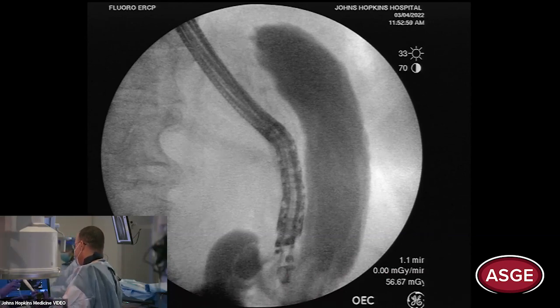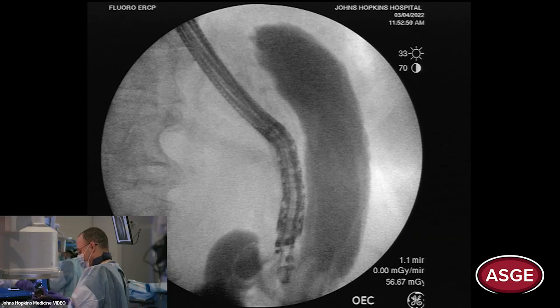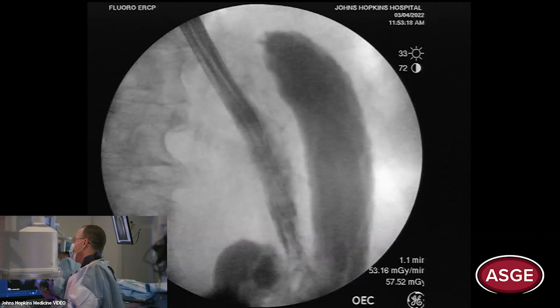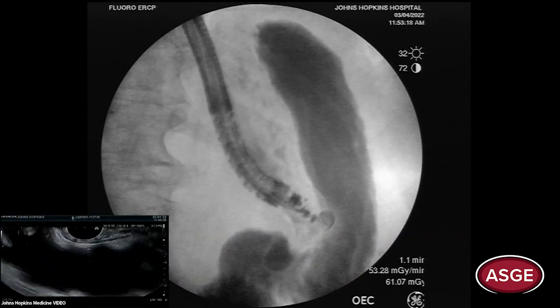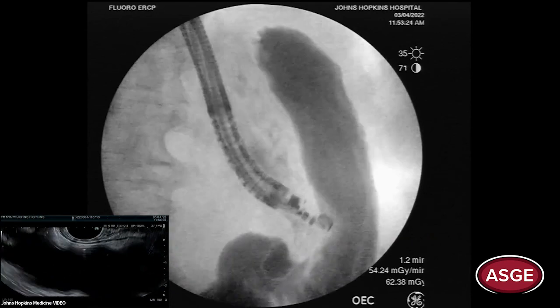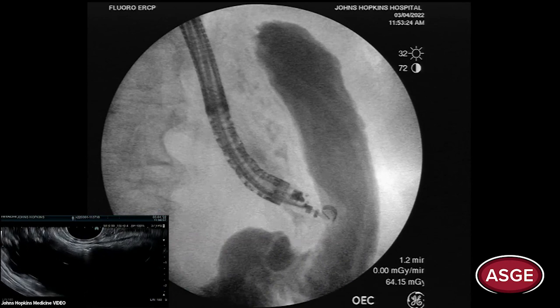That looks good — let's take the needle out. Usually it's about 300–500 cc's. This was about 300 cc's. Now under fluoroscopy, pull back a little bit — you'll indent it with the scope fluoroscopically and know you're very close. Ready for the 20-millimeter AXIOS.